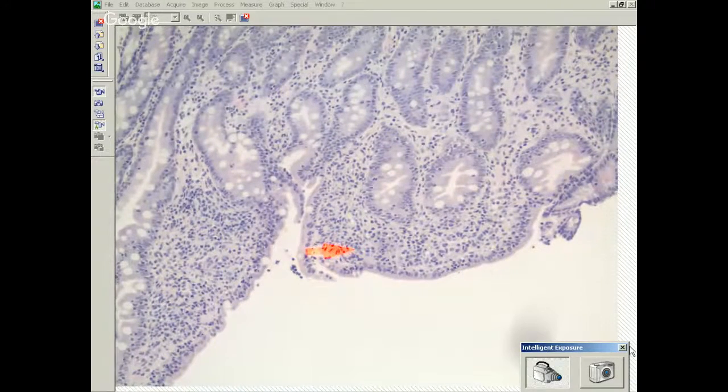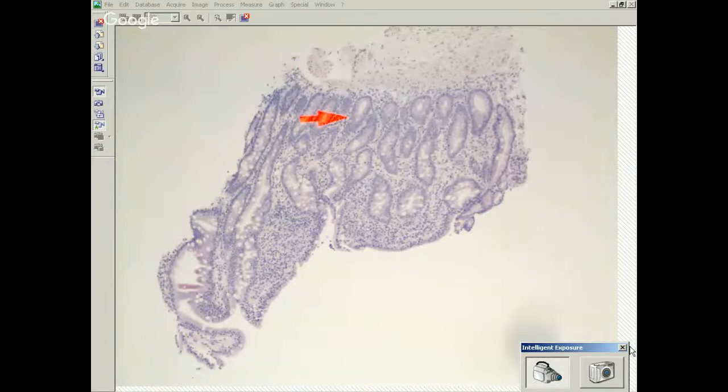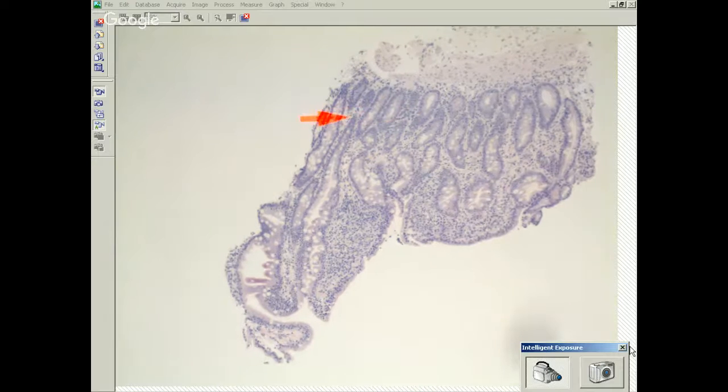Right. There's actually no plasma cells here, but it doesn't look like the lamina propria is vacant, right? It's actually full of other inflammatory cells. So if you were just going through this pretty quickly, you may not notice that there are no plasma cells here at all. So this is a case of CVID. It looks just like celiac disease. It tends to have a little bit more active inflammation, but it doesn't necessarily have to. You can get this villus blunting, intraepithelial lymphocytosis, and there are actually no plasma cells here.